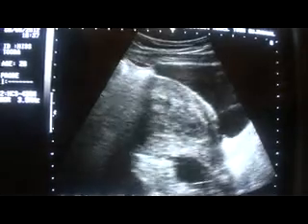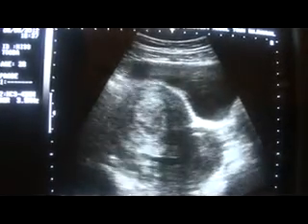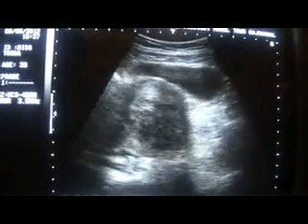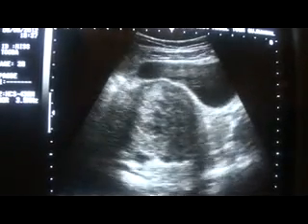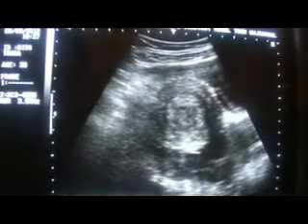So this fluid and this pocket of fluid can well represent rupture of a left adnexal cyst.